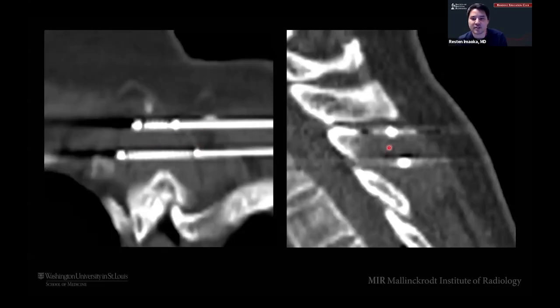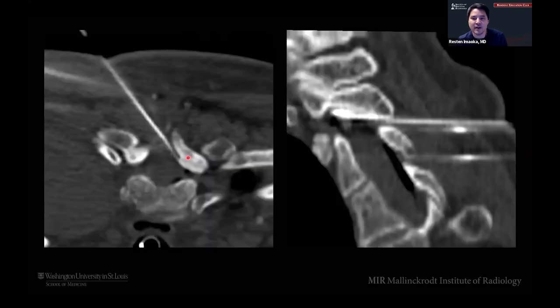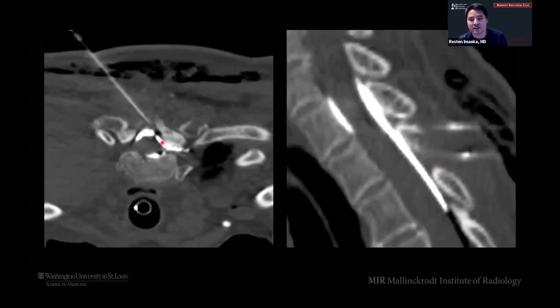We used a couple probes here to build a decent ice ball around it, and then we start to do some thermal protection, right? And so this is where that active thermal protection comes into play, where we put a spinal needle down interlaminar here into the epidural space. We put some CO2 in right here. If it doesn't go where you want it to go, then you put in some contrast or D5W or whatever instead, right? Something to physically displace the cord away. And these are all active thermal protection techniques.